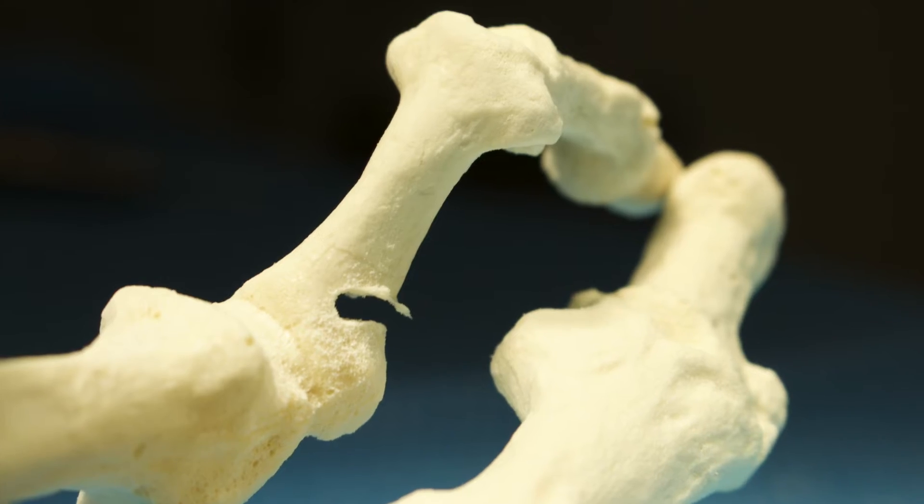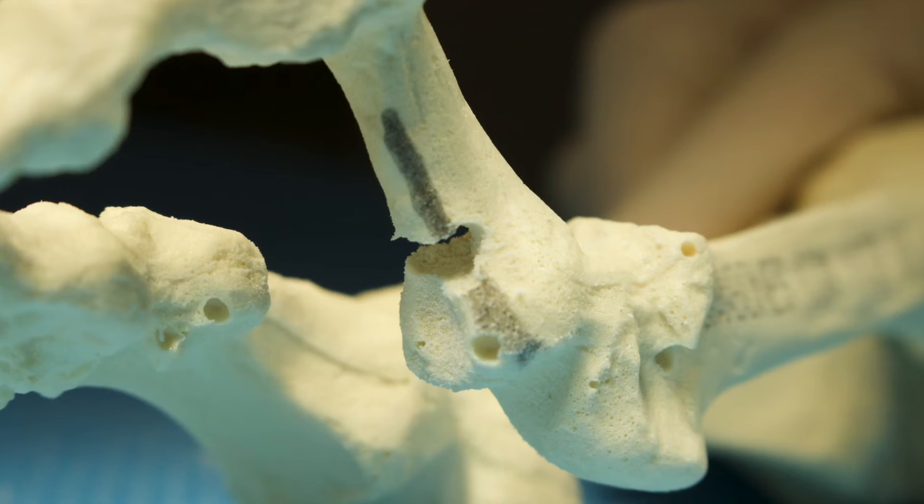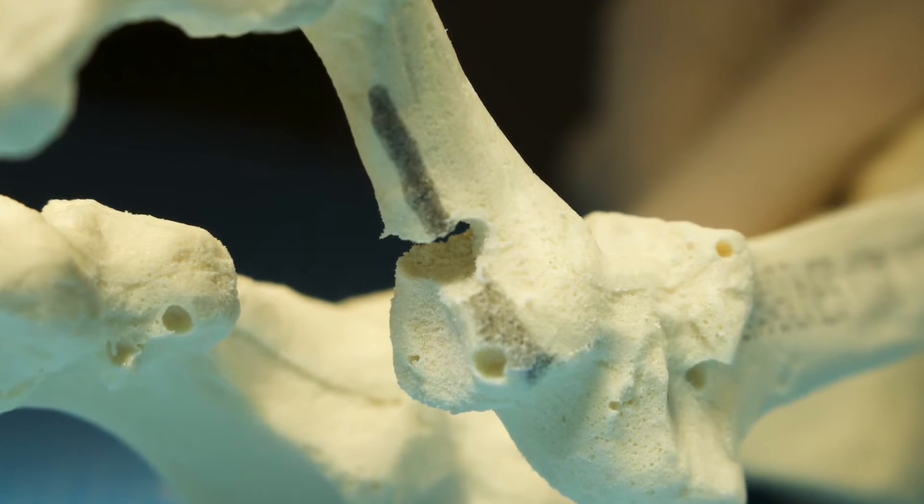These saw bone photos demonstrate the final extracapsular closing wedge osteotomy and in particular highlight the plantar lateral cortex which has been cut with the burr.